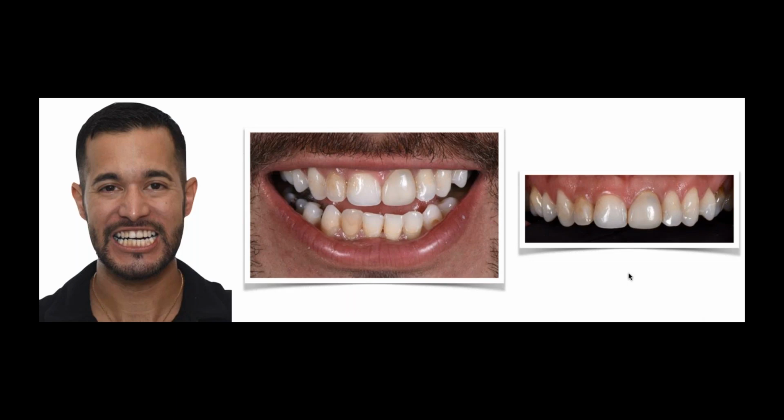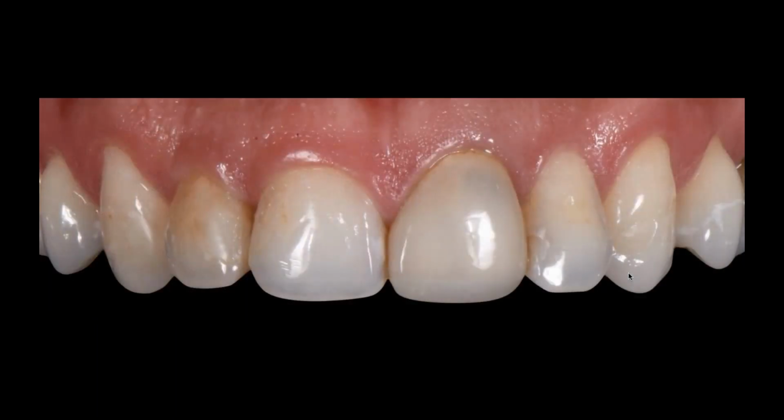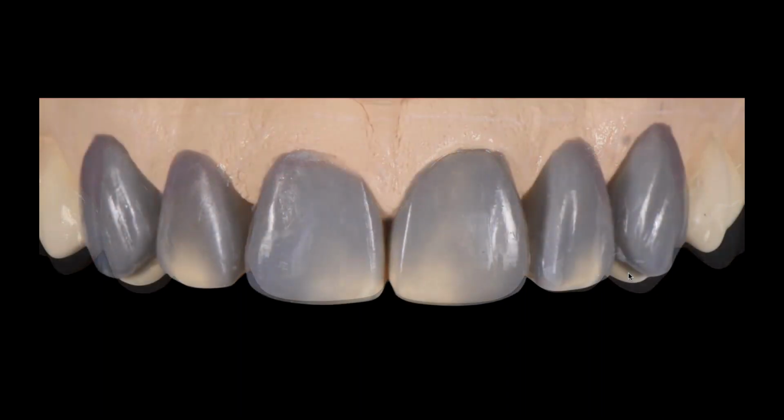This case is a few years old now, but the point of it is you can see they don't work. It looks like number 9 is probably a monolithic restoration, maybe lithium silicate, and you see you're getting bleed through, so there's no opacity. You're getting the actual color, the preparation popping through. The discoloration on the 7, very similar. So management-wise, the space wasn't managed well, either from the prep design or from the understanding of the restorative options. So in this case, if we take a closer look, there's a lot of aesthetic challenges. I won't go into all of them today just for time, but obviously the gingival architecture is not where I want it to be. We're going to address that.